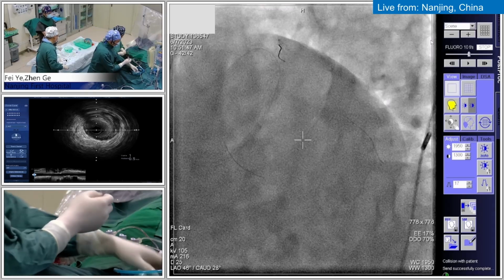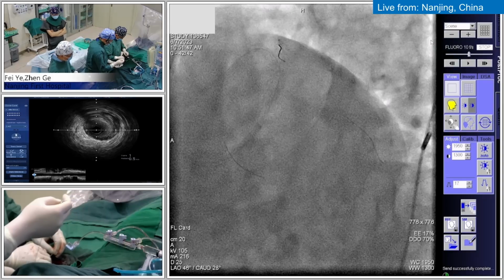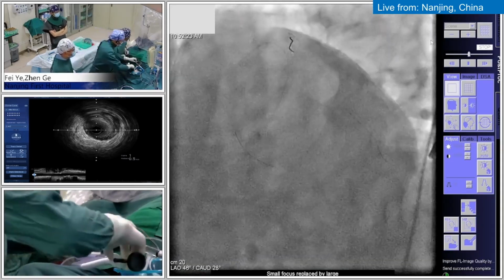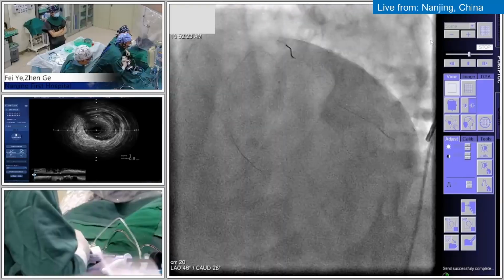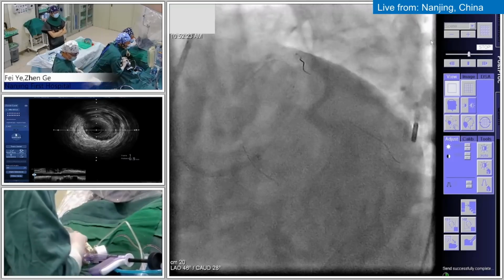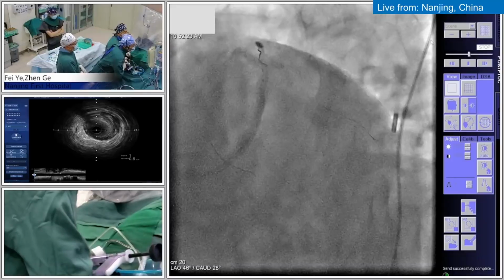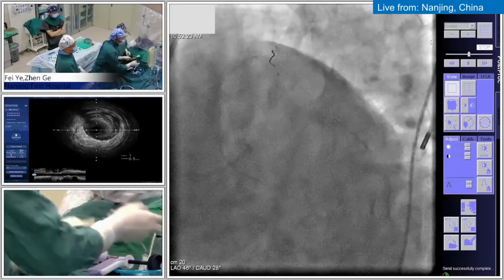How to precisely position the 5.0 balloon distally? Yes, very tough. Sometimes we use the POT balloon, for this, a conventional NC balloon. We use the distal mark to pinpoint it in the POC. I think located in the POC is okay. A little distal, pull back. We don't want to cross over the POC.